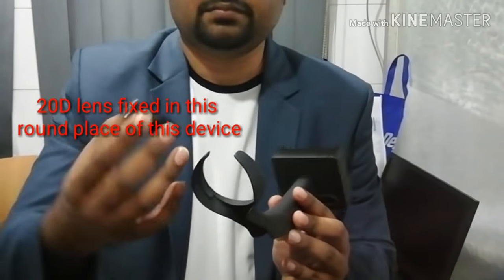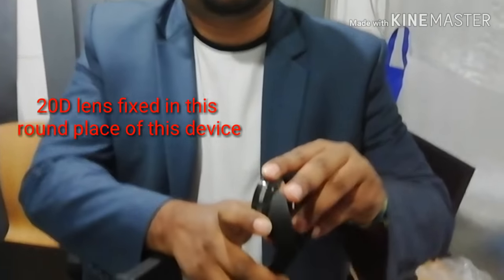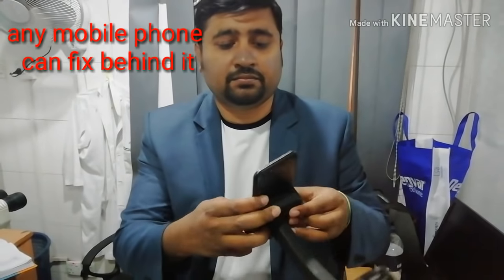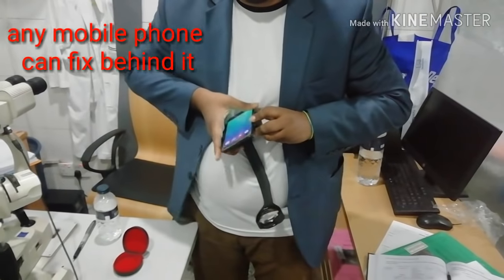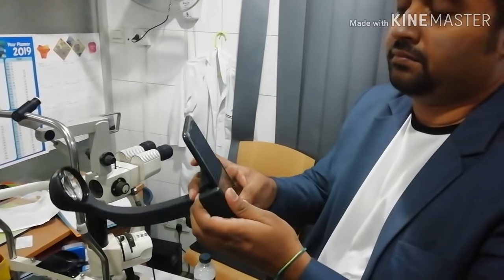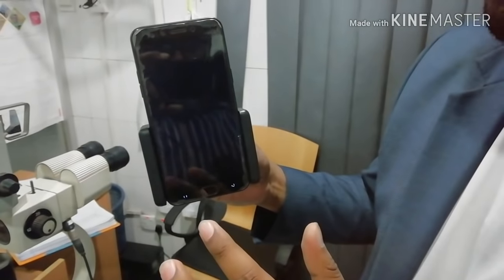First, the 20D adapter lens has to be fixed in the anterior part of this device. You have to fix this 20D adapter very gently. After that, any mobile phone can be fixed in the posterior part of the device, as you can see in the video.